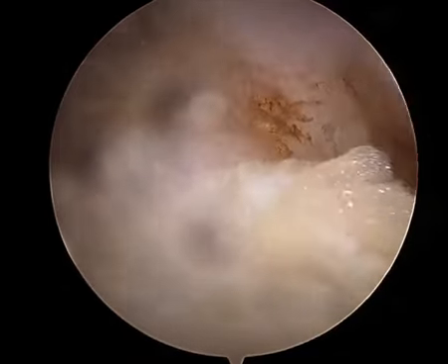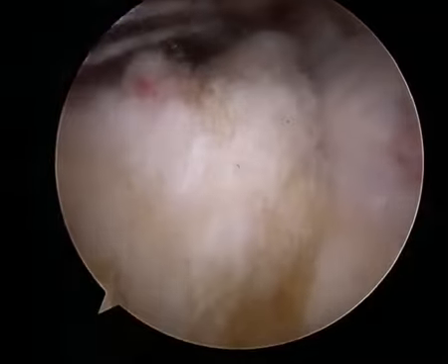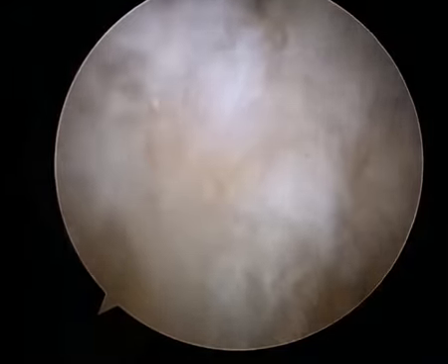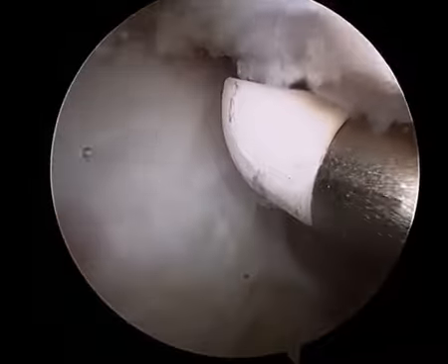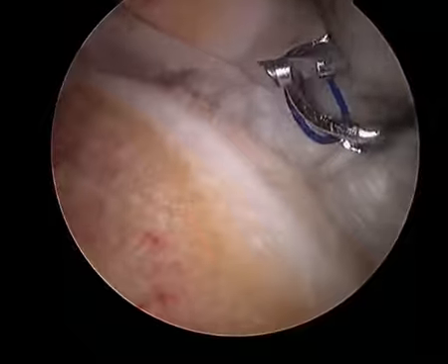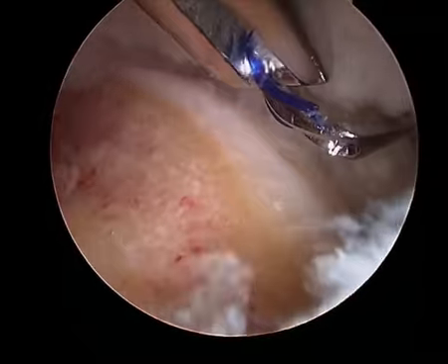After T-capsulotomy, we place a traction suture on the lateral capsule flap. Elevating the capsule flap gives us much better exposure of the peripheral compartment. We now use the same method, placing a traction suture on the medial capsule flap to improve arthroscopic visualization.